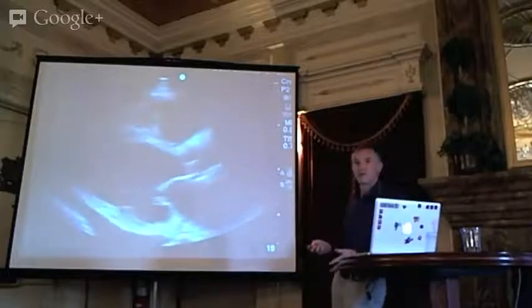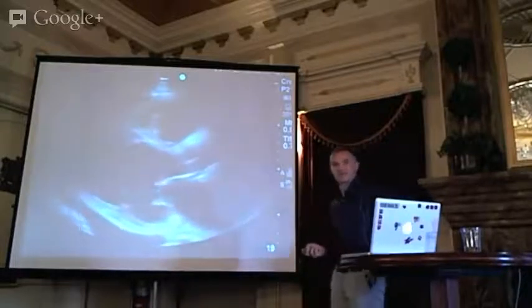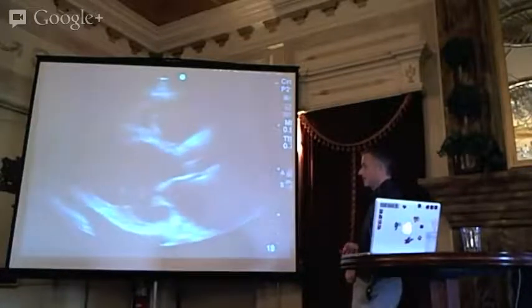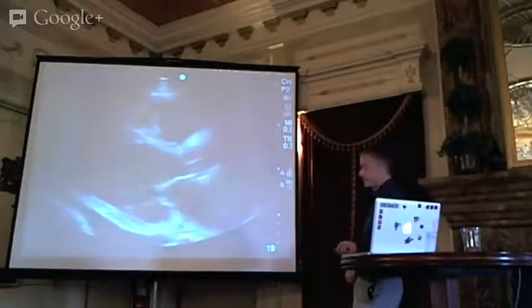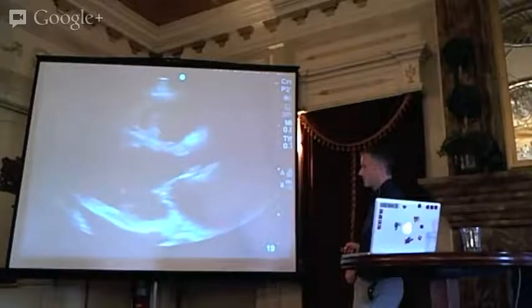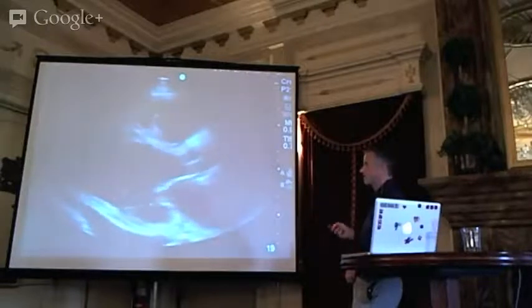Is it pleural or pericardial? Well, it's pericardial, but the way to confirm it is to look at the descending aorta. If you saw fluid back here, you might wonder whether it's pleural or pericardial. You can't see it very well here, but the descending aorta appears as a black circle just underneath the left atrium. Left pleural effusions appear deep to that, whereas pericardial effusions are between it and the heart. This is pericardial, definitely fluid.